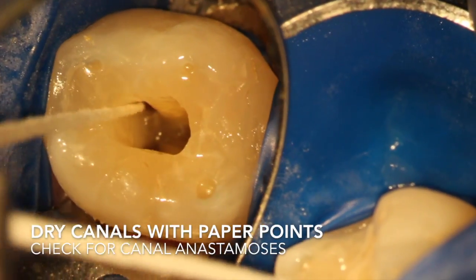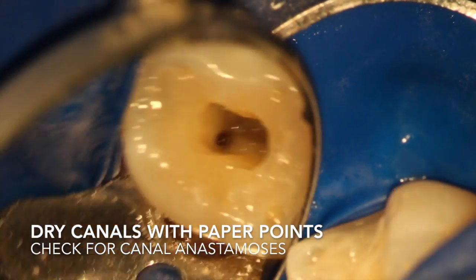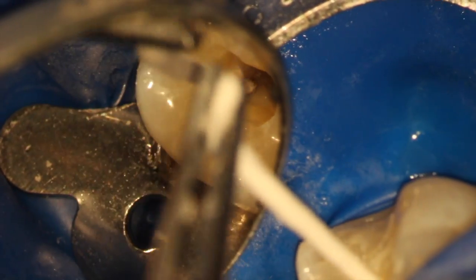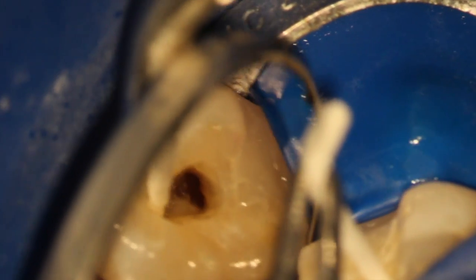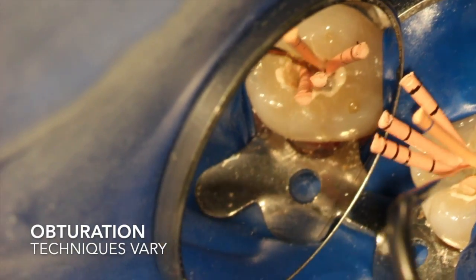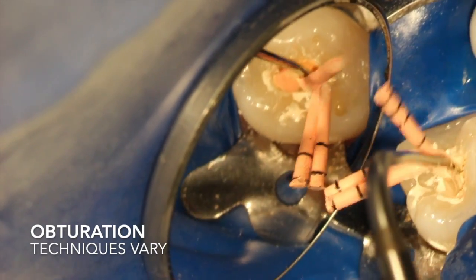The ultrasonic agitation is really to agitate the EDTA and get that smear layer really clean, clearing all the debris generated by instrumentation. When we dry the canals, we keep looking and inspecting under the microscope to look for canal anastomosis or other connections between canals — there may be little fins connecting them, hinting at mid-mesials or other canals. Even drying with paper points is something where the microscope is important to use.